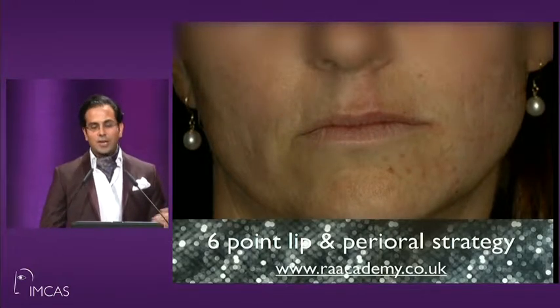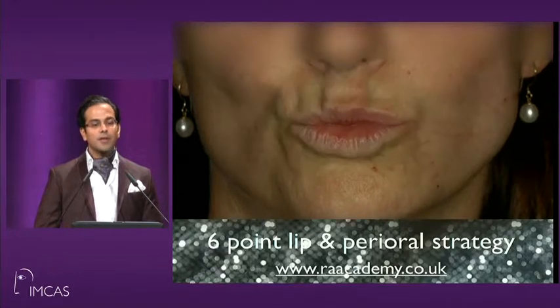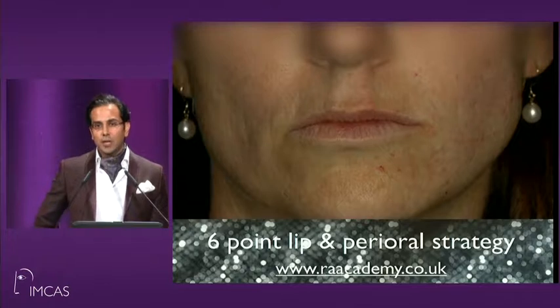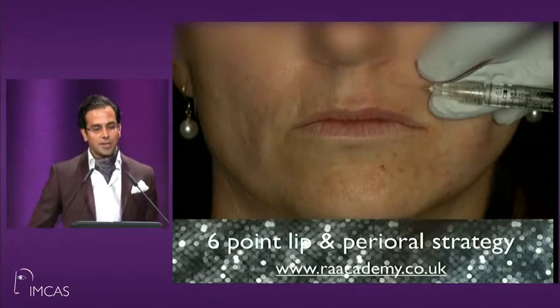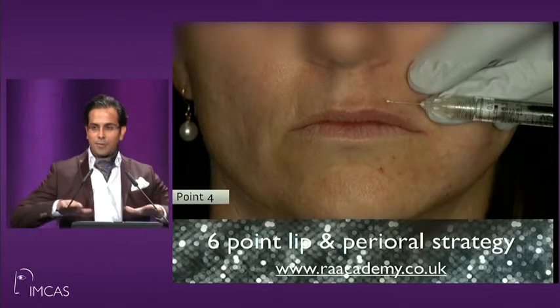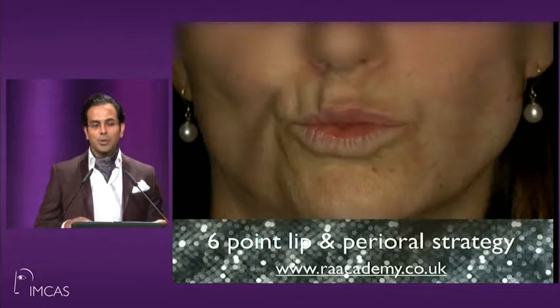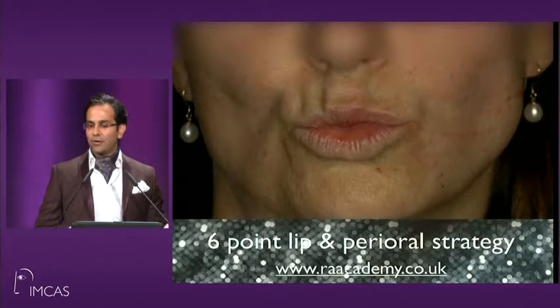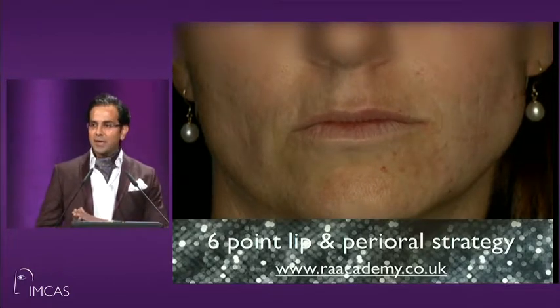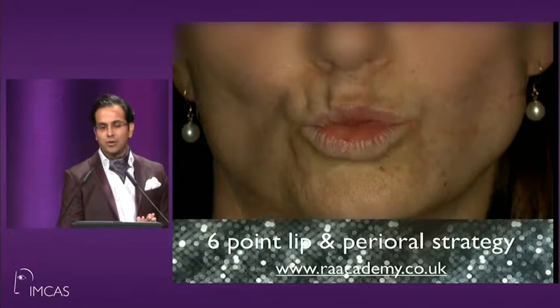So you can take a perpendicular approach to perioral lines and wrinkles, and then you can inject them intradermally, so very superficially, especially using a low molecular weight hyaluronic acid product. And what you're doing is you're pushing the skin away from the wrinkle either side and improving surface tension and turgor, which completely obliterates the perioral lines. In fact, what happens because of surface tension is that you get a midline deviation and the Glogau-Klein point is pushed to the non-treated side.